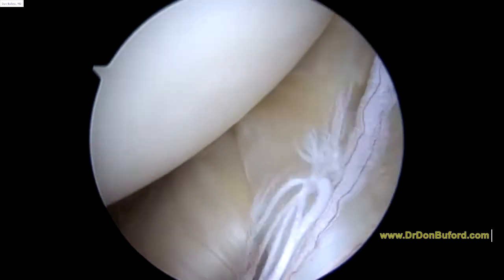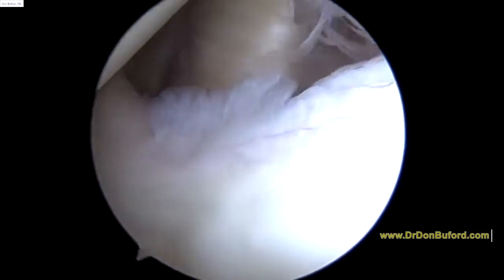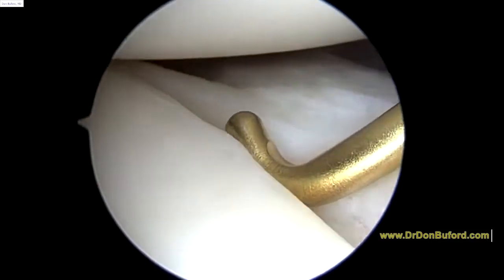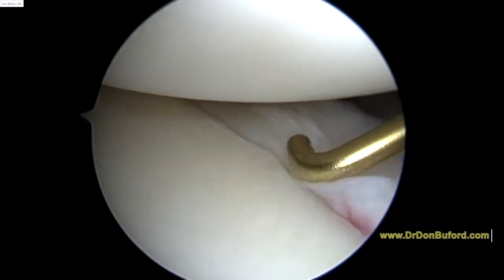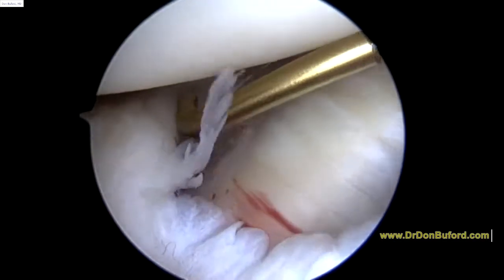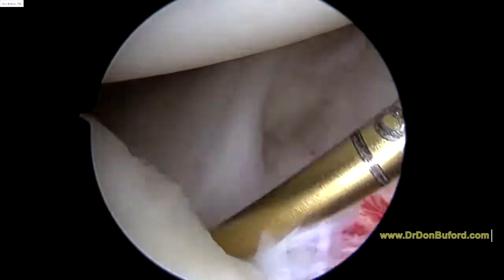As we rotate the arm, you can see that. So as we look farther down the front, we can see the anterior glenoid here looks pretty good. And then the inferior glenohumeral ligament is this structure right here. Again, just a little thickening in the capsule. That's it, right there.